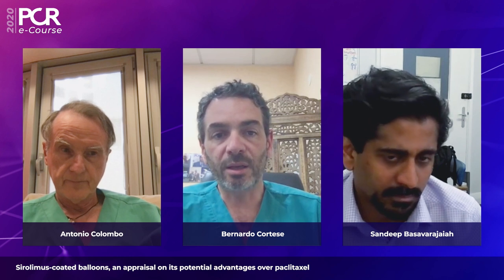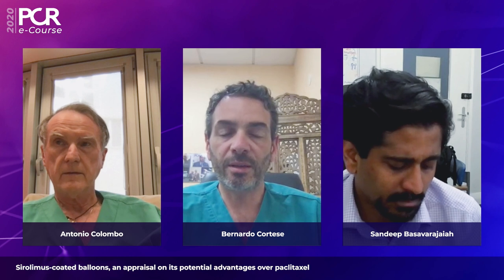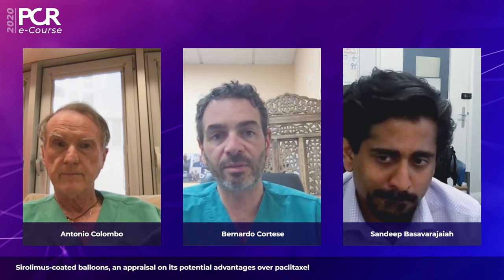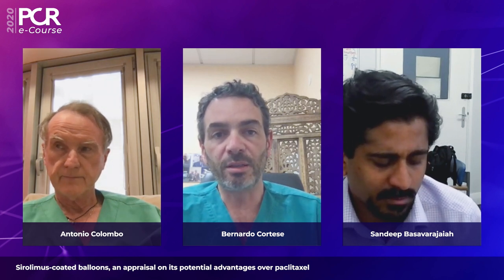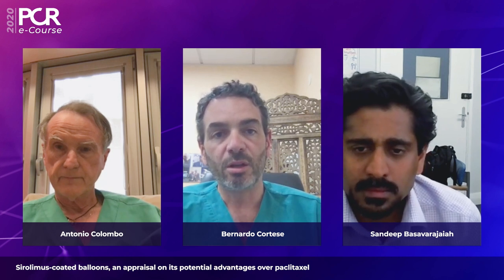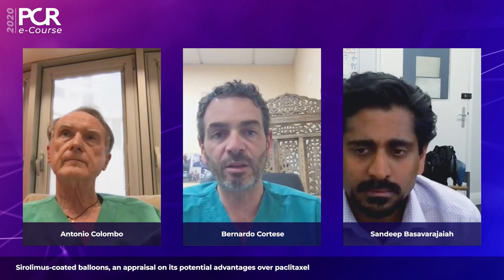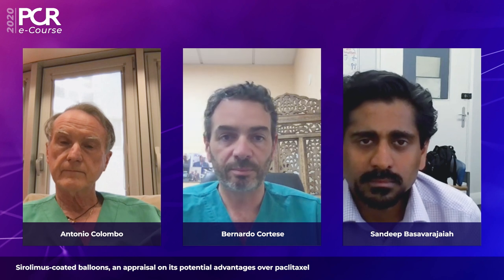I would like to ask Antonio one question. We have seen from the very beginning of our experience with Magic Touch that this device has very improved trackability and deliverability. So it is easier to use this device in more complex lesions. And I would like to have your opinion on this and if you have extended the use of drug-coated balloons after Magic Touch came into the market.